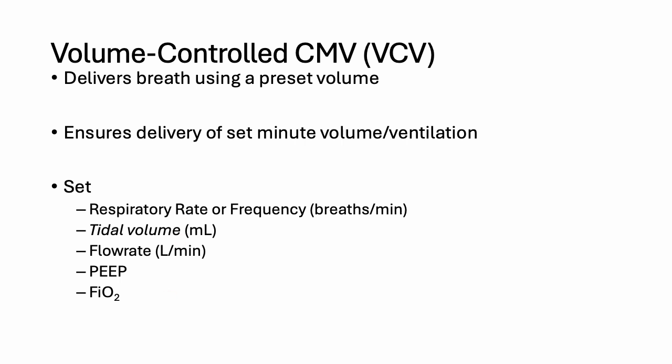Okay, now contrast this mode with pressure controlled ventilation. What is set? Okay, the difference. Spot the difference. I'll give you 2 seconds. Okay, this is the main difference. In pressure controlled ventilation, we set the inspiratory pressure. In volume controlled ventilation, we set the tidal volume. Okay, then you ask, isn't the flow rate different?